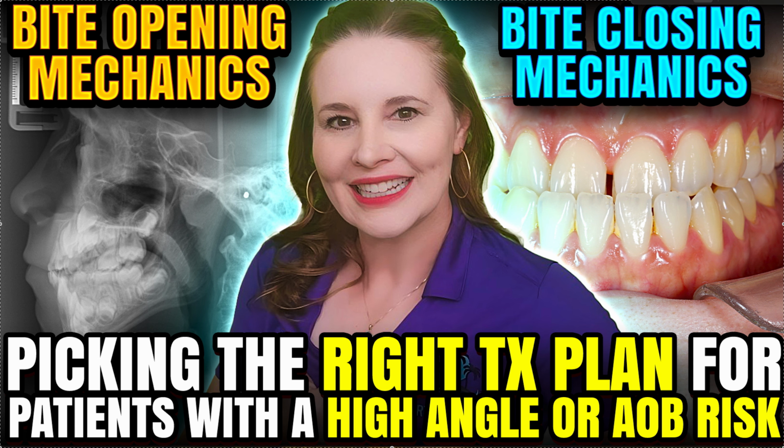So I'm gonna do my best to talk about mechanics that open a bite, and by opening a bite, I mean taking a slightly deep bite and leveling the curve of Spee and opening it a little more in the front so that we don't have such a big vertical issue.